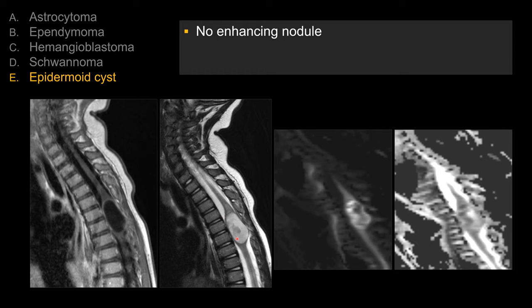On T2-weighted image, there's a cystic expansion. On diffusion-weighted sequence, you see bright signal on DWI and dark signal on ADC — so there's restricted diffusion and cystic expansion without enhancement. The best answer here is epidermoid cysts.